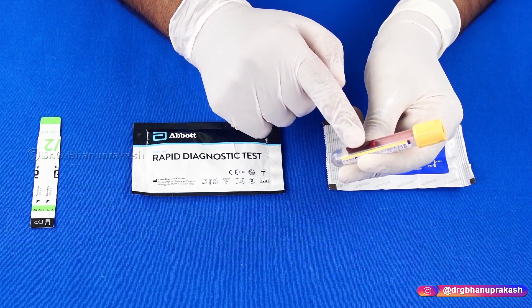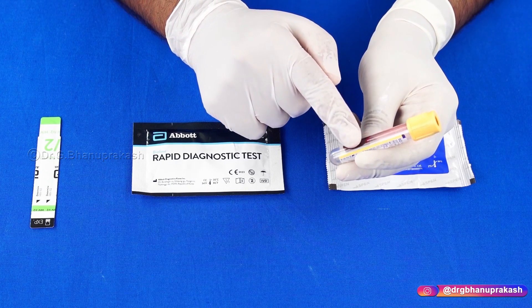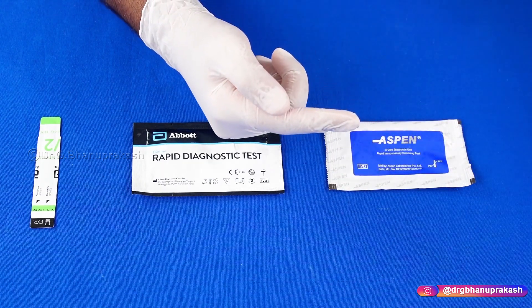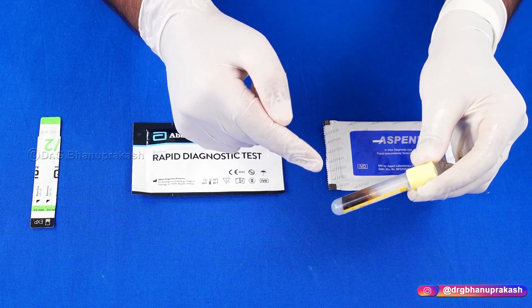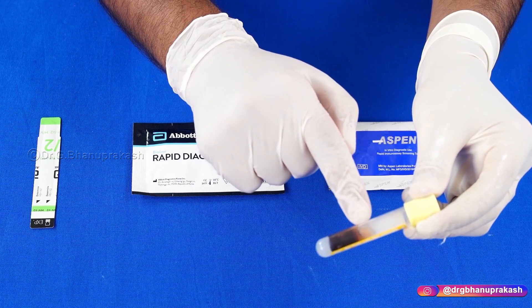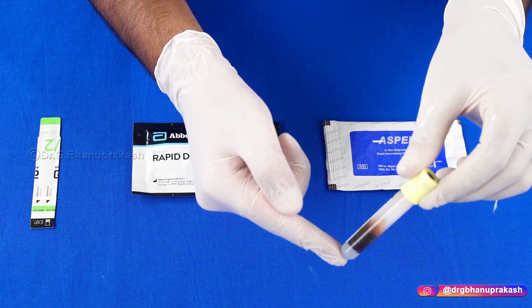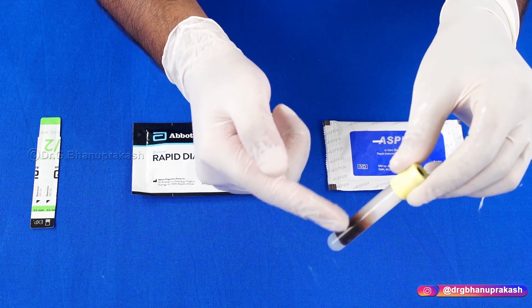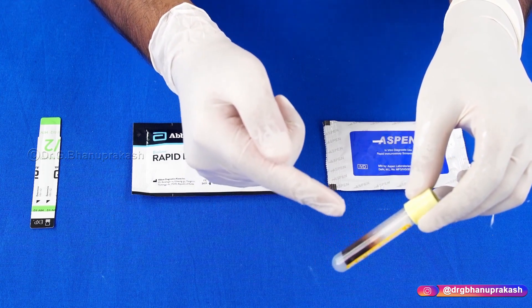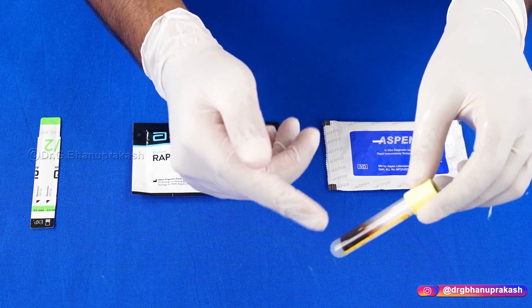You need to store the blood in the container and let it clot. Once the blood clots, it leaves serum above it. As you can see in this sample, this is the blood clot, and just above the blood clot you can find the serum which is formed. This serum contains the viral antibodies, and we shall look at exactly what viral markers this blood is carrying.